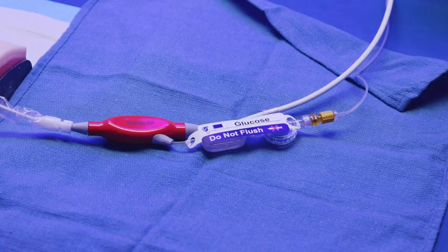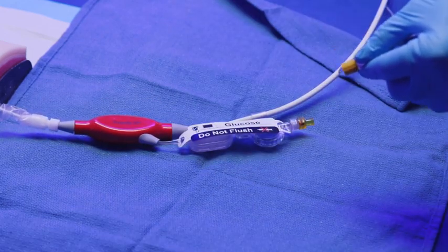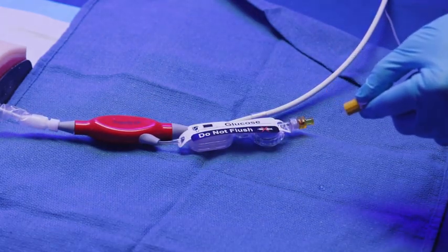To flush the purge fluid from the cassette, disconnect the yellow lure from the Impella catheter. Do not use a hemostat to disconnect the lure, as this could damage the Impella catheter.